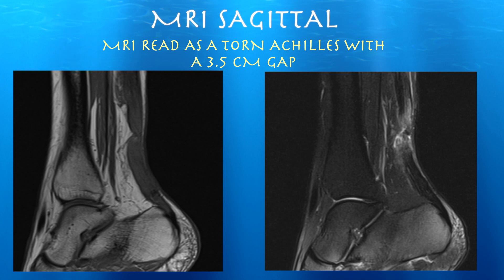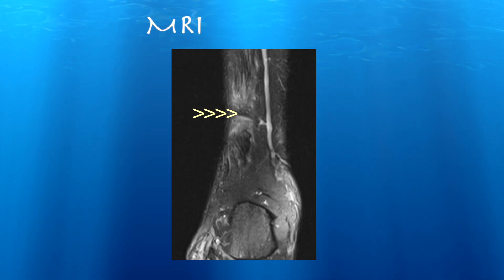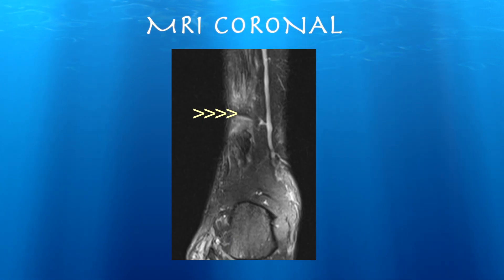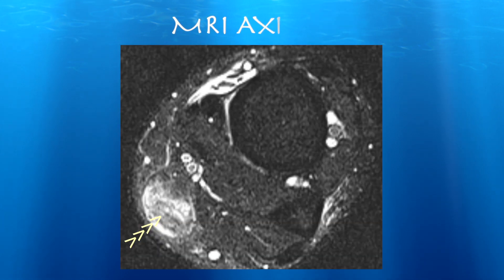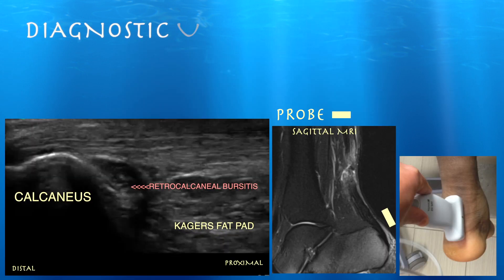Here are some sagittal MRIs where you can clearly see a tear, easier to see on the fat-saturated image on the right where you have all that signal. It was read as a gap of about three and a half centimeters. Here's an axial view where you can see all that signal within the Achilles consistent with a tear.